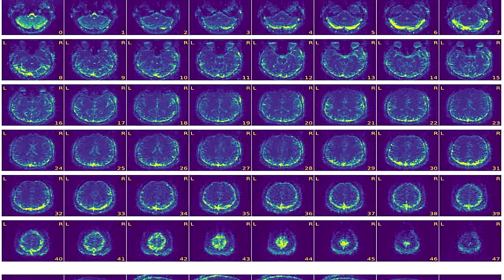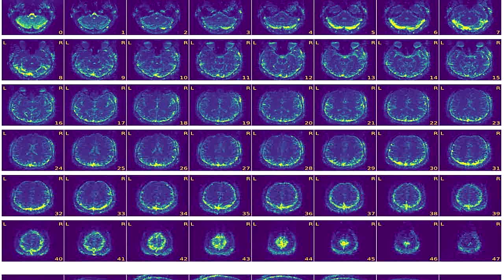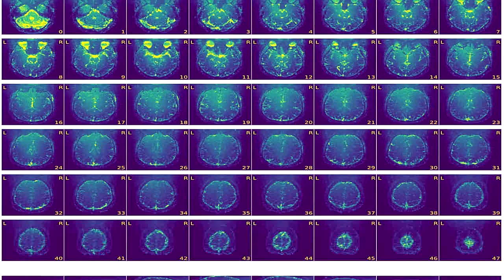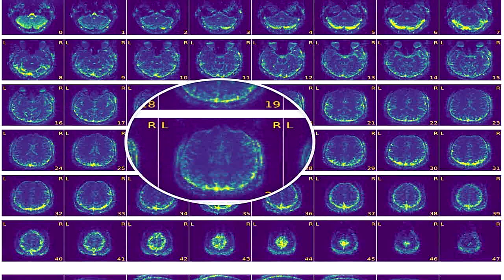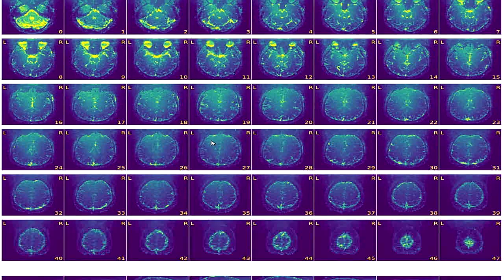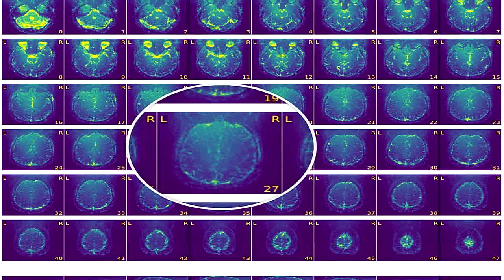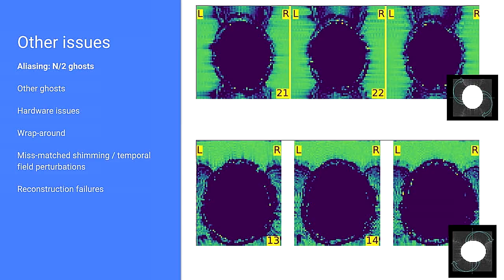However, if we look at the standard deviation map corresponding to the same data set, this is with pre-scan normalization, without, with and without, and once more. And this is the typical look of the standard deviation map of an fMRI scan. And here you can see how pre-scan normalization didn't raise the SNR of your image. So you have a lot of noise.